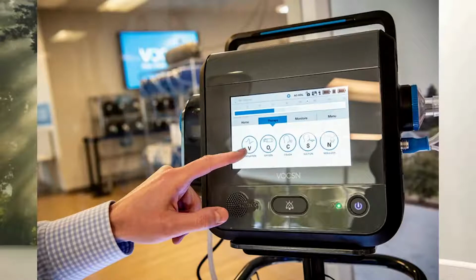Yeah, Ventec was building a medical device. It's their VOCSN product. The VOCSN is 5 devices in one, so it's pretty revolutionary, but it's very similar to what we're seeing happen in a lot of the medical fields these days. People are trying to build a device that has more functionality, brings different things together, offers a richer display and user interface. The main piece that the VOCSN does is the V is for ventilator, and there's also other pieces inside of there: oxygen, cough, suction, and nebulization.